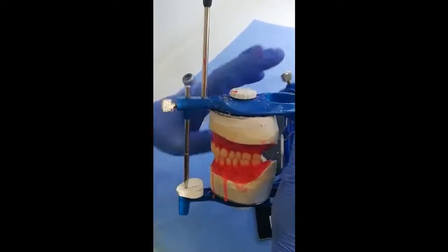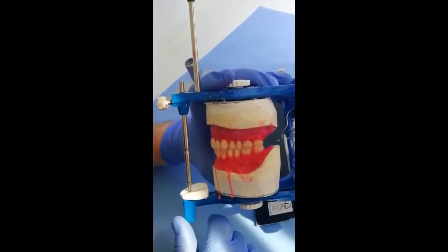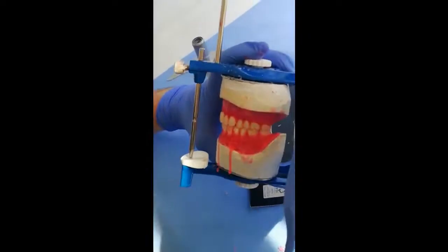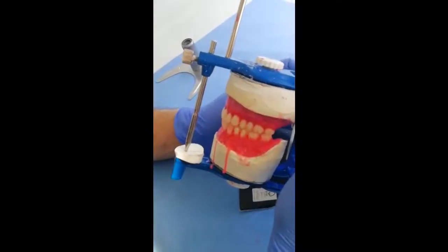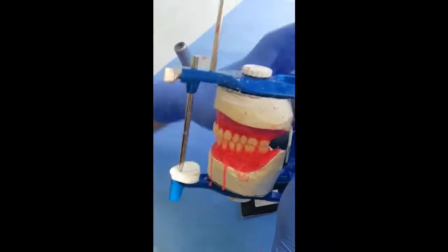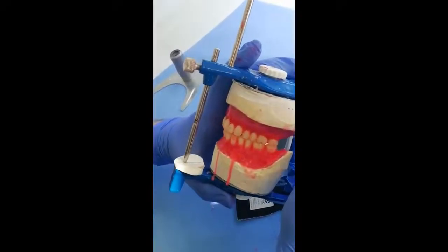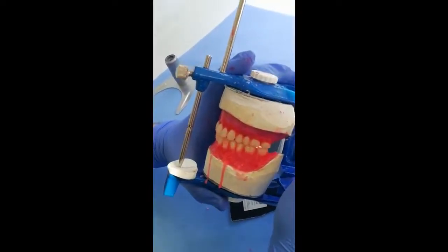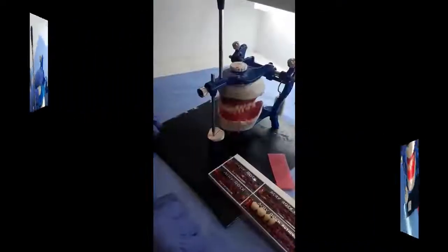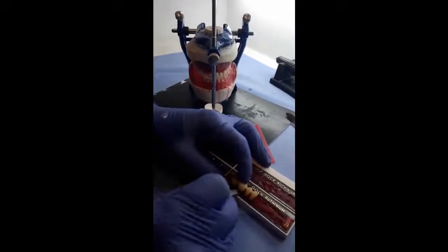Now we'll proceed for the setting of the right side of the mandibular posterior teeth to also check and demonstrate how we can achieve the balancing contact during lateral excursions and to demonstrate the balancing and working side. Okay, now we proceed for the setting of the right side.